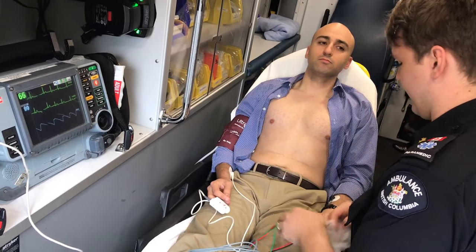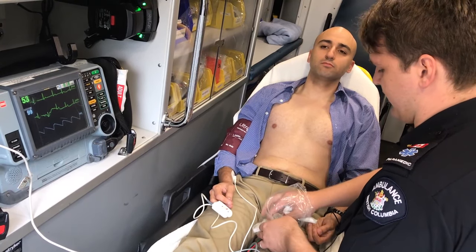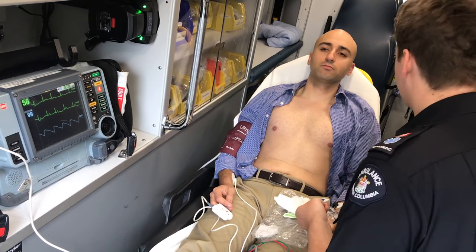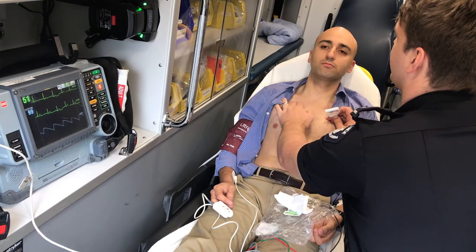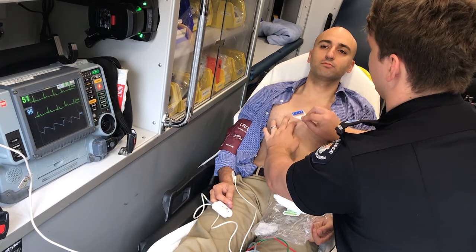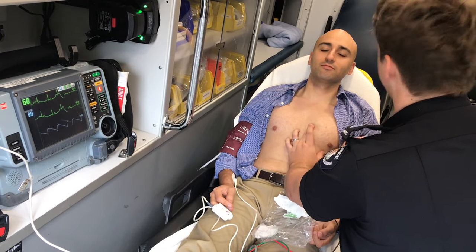Alright, assuming I've already consented the patient. I've got your skin prepped. Feel down from the 1st, 2nd, 3rd, 4th intercostal space. 4th, 5th.